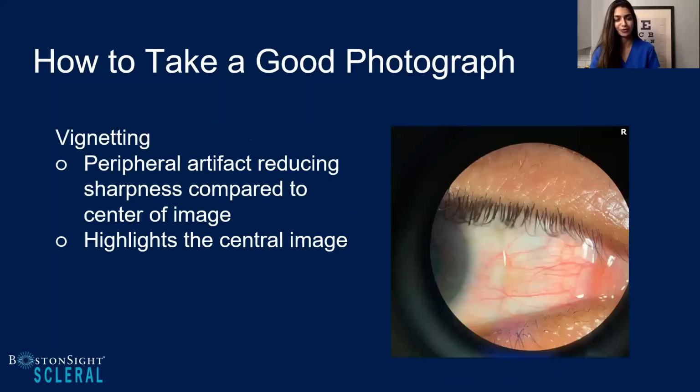We've all taken photos and then looked at them and kind of had a question mark in our head. And I can tell you the same applies for this concept in vignetting. Shalu and I have both been laughing about portrait mode and how we all use it on our iPhones. And really with portrait mode, the beauty of it is that it blurs out the periphery of the image so you can really focus on the center portion of your image.